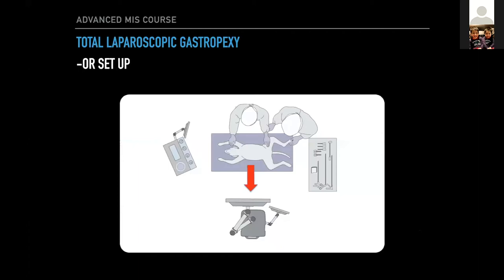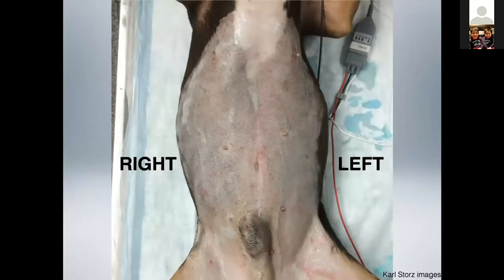Setup is nothing fancy. Clip, prep, and drape as you would for an open gastropexy, maybe clip a little bit wider down the right side, just like you would for an assisted technique. Here's port placement, and as I'll go through the video, port placement is critical for this, at least for me. If it's a female, I'll put a SILS port in here, maybe even more caudal to do the ovorectomy.